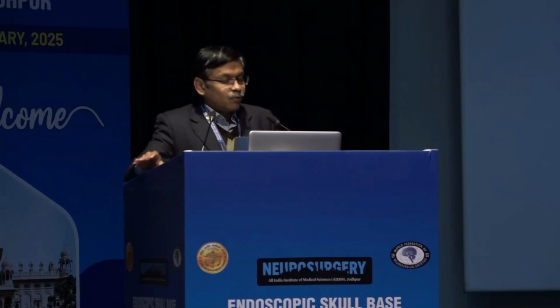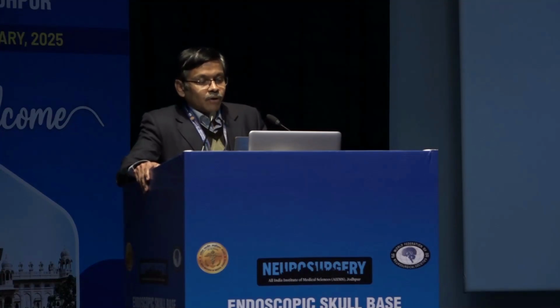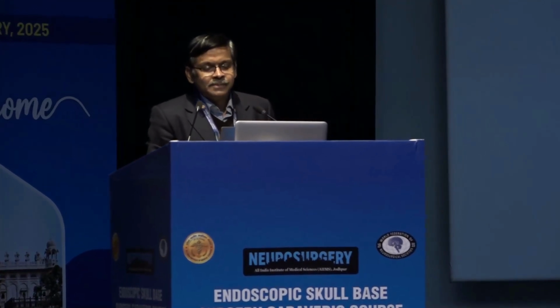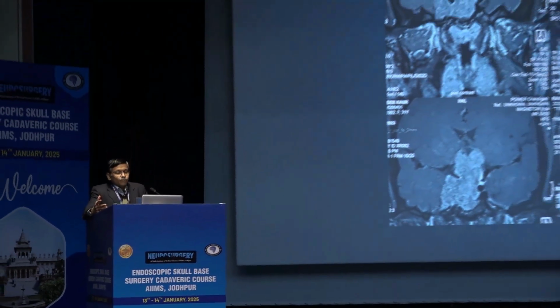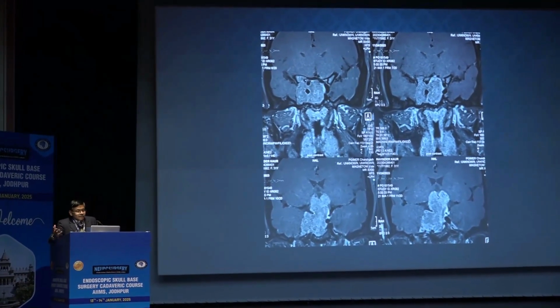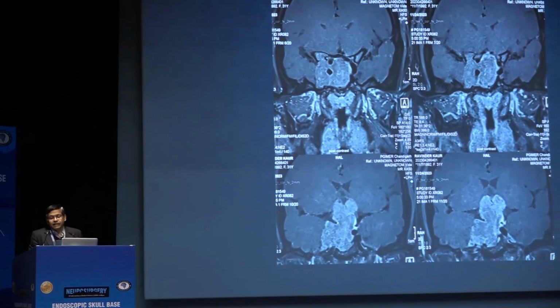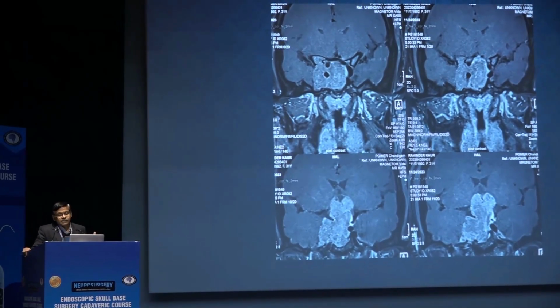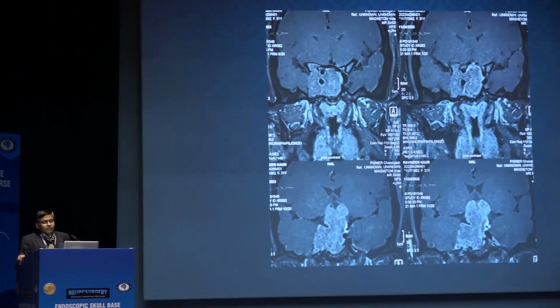I'd like to focus on our philosophy of endonasal endoscopy for Knosp grade 4 ICA encasement in cases of pituitary tumors. Sometimes we wonder, in such tumors, whether we should do aggressive surgery at all, or just remove the cellular part and then give gamma knife or radiation. Whenever we are considering such cavernous sinus invasion with a complete encasement of the ICA, we do aggressive surgery as much as possible, for three main reasons.